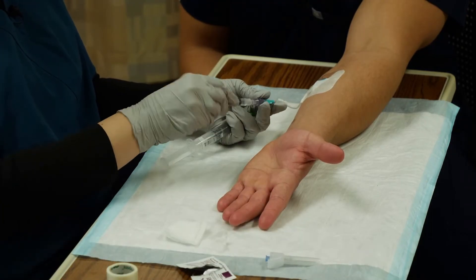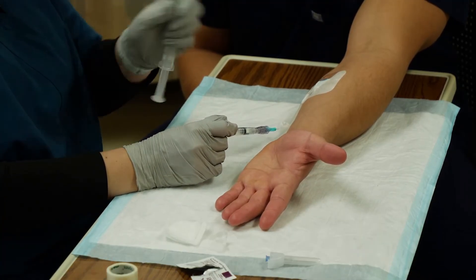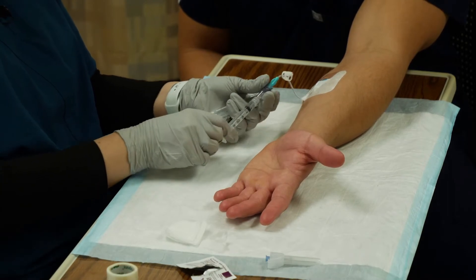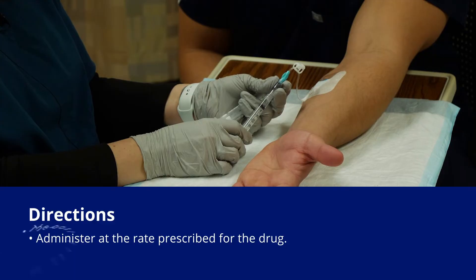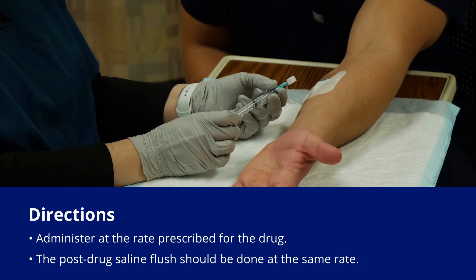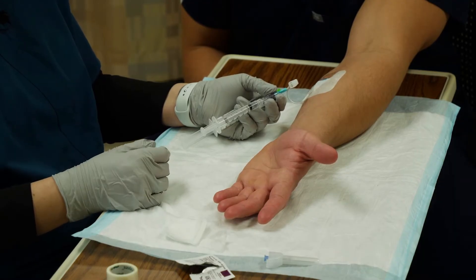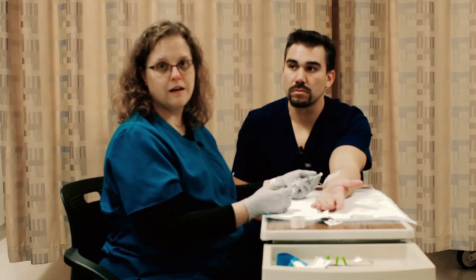Now I'm going to attach to my luer lock again and look at my watch. You can also count the seconds out loud in your mind if you don't have a second-hand watch. So if I know I need to push this over about 30 seconds, I'll push maybe a quarter of it, count in my head, then push a little more and count again. One minute is the guideline for lots of IV medications, and some are even a couple of minutes. If your IV push time comes out to be more like five minutes, you really should consider putting that in a mini bag and hanging it as a secondary.